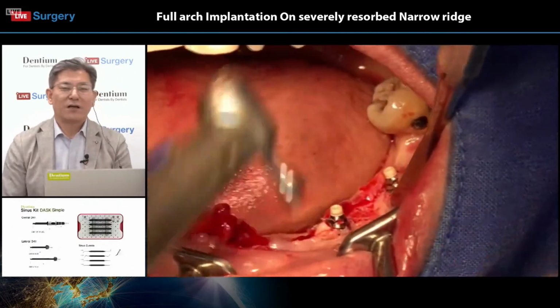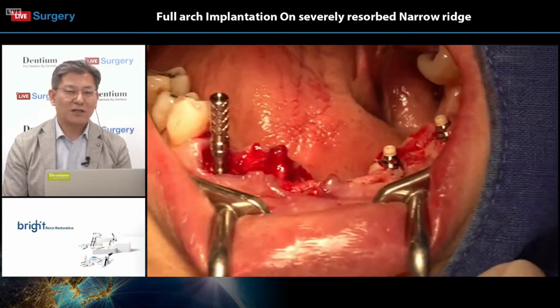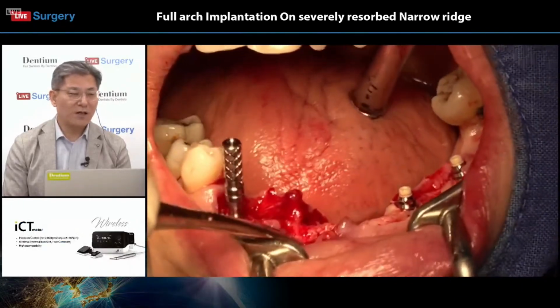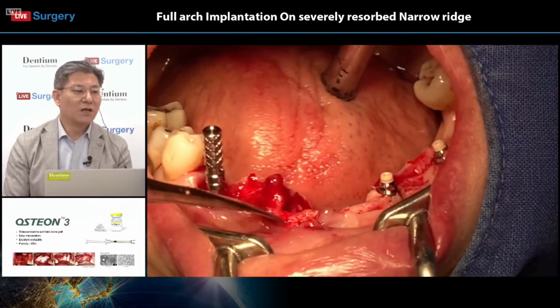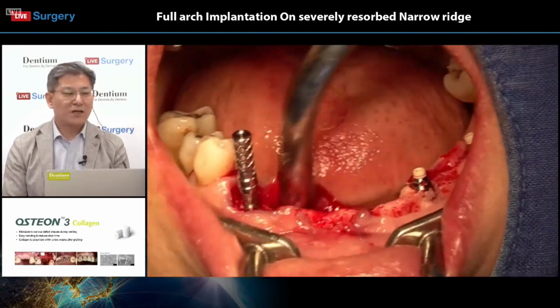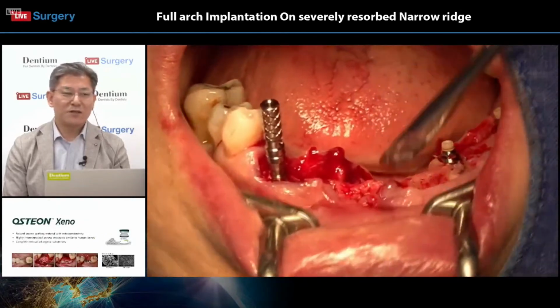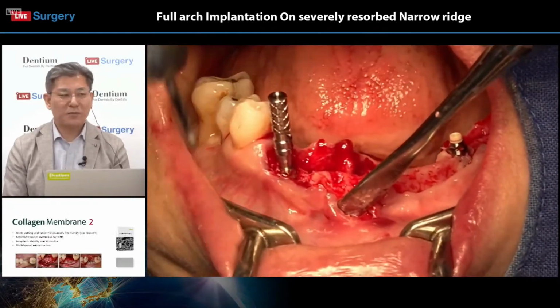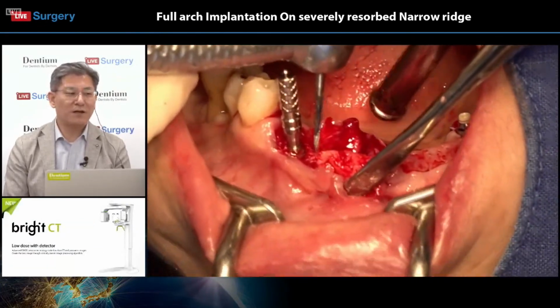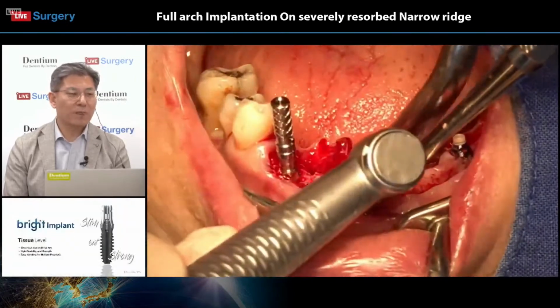However, as I mentioned before, the tissue level is stronger than a bone level implant fixture of the same diameter. So we can apply it in the premolar area and even the molar area. Especially for elderly or compromised patients, this smaller diameter can be applied if we choose a tissue level implant.